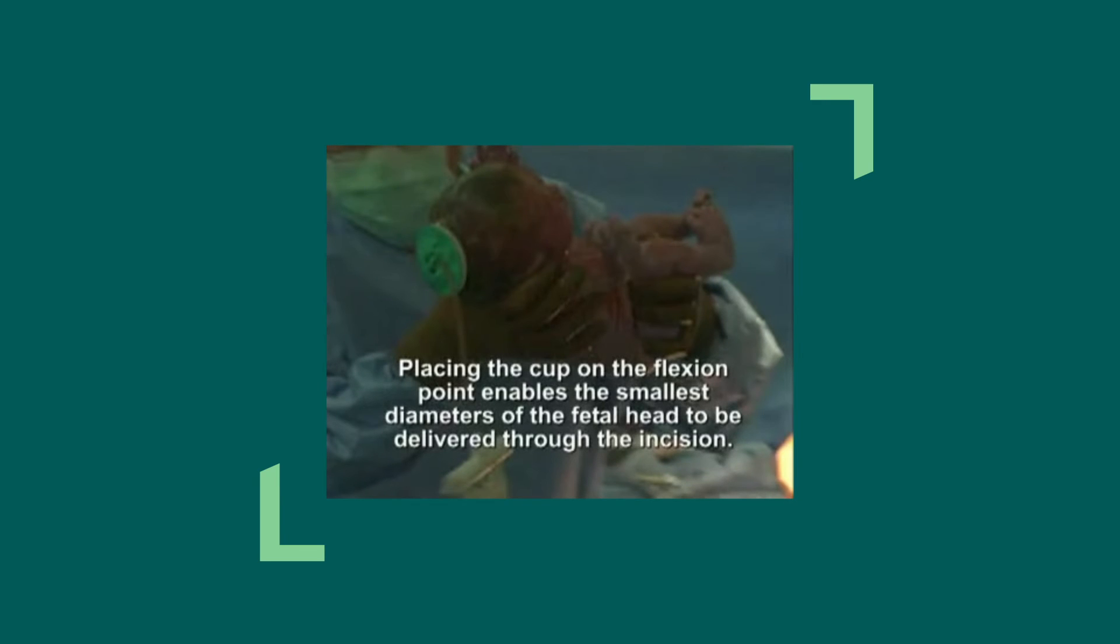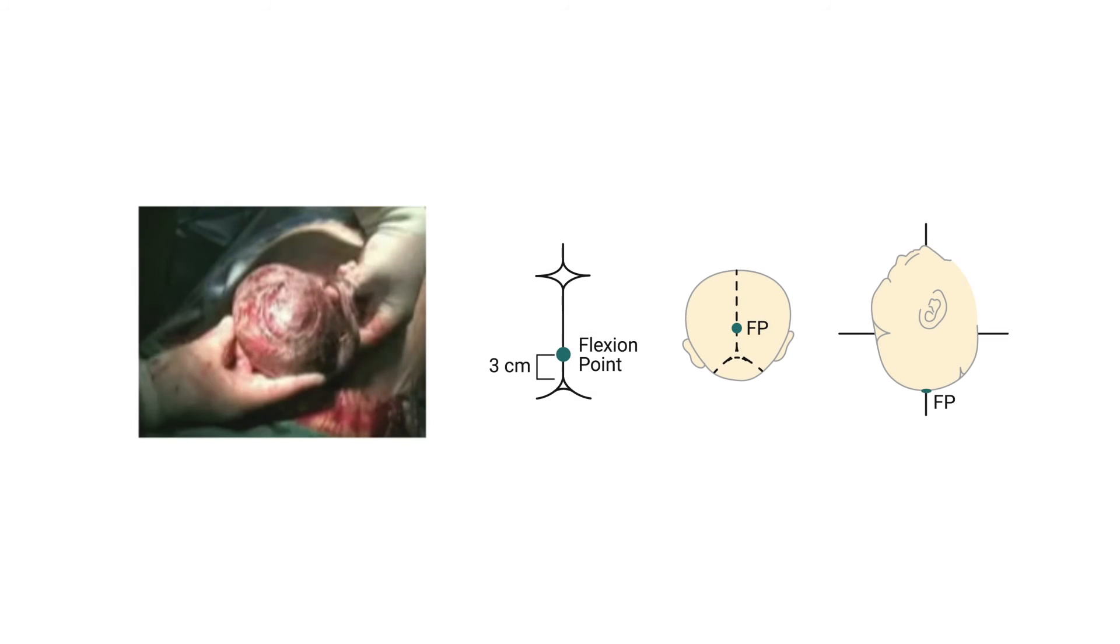In this procedure, it is evident that the Kiwi Omni-C cup was placed on the flexion point 3 cm anterior to the posterior fontanelle along the sagittal suture. Placing the cup on the flexion point enables the smallest diameters of the fetal head to be delivered through the incision.